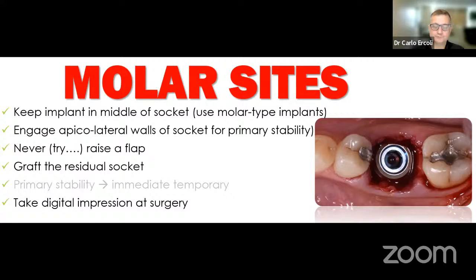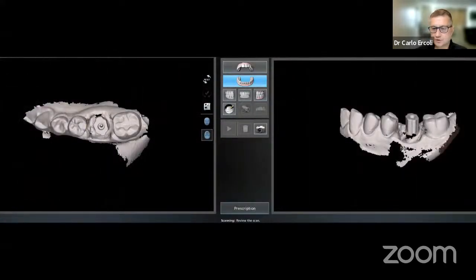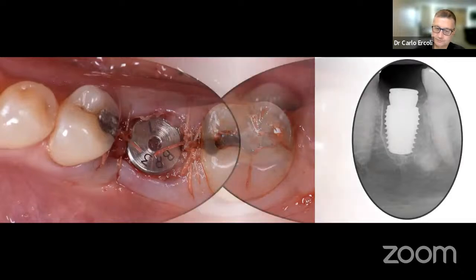And remember what we said before, if you're wondering about the soft tissue emergence profile, remember what we discussed about doing those mesiodistal incisions. So the implant goes in place. You can see right here it is in the right position. This is an old scan with a scanner from 3M. Today we use mostly Trios and other types of scanners. But effectively, here is the end of your surgery. There is some bone graft, there are some interrupted sutures, and the patient is ready to go.